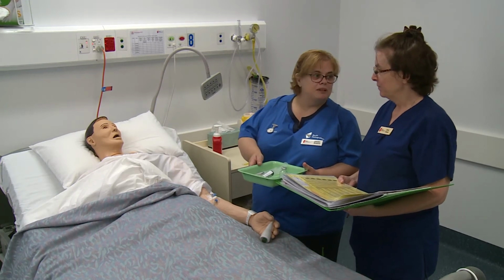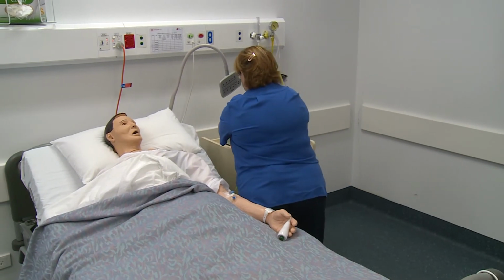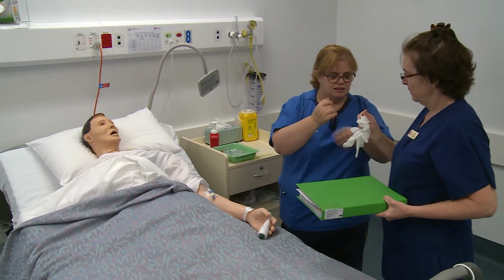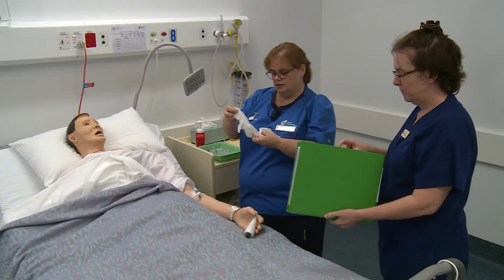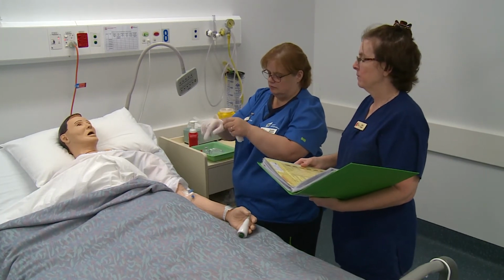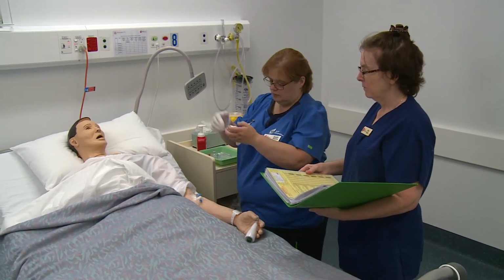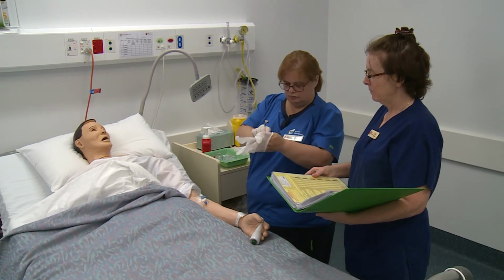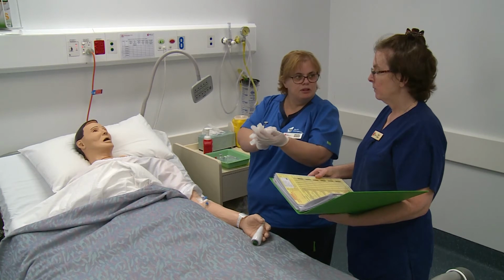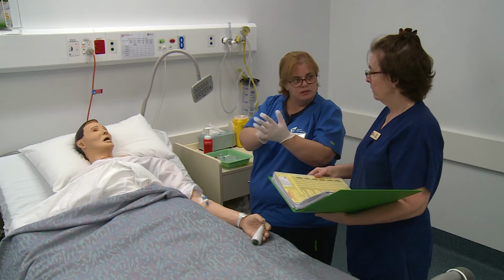Could you possibly get me some gloves, Jerry? Sure. Thank you. Okay. Just let that dry in. So I'm going to give this over 3 to 4 minutes, as the Australian Injectable book said.